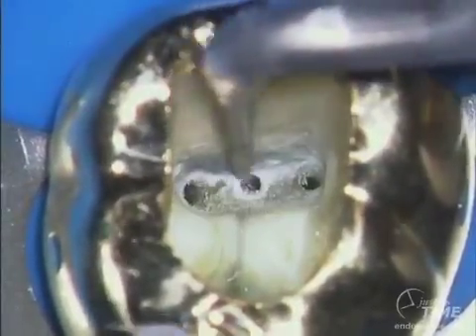Ultrasound can smooth and refine and do precise amounts of detailed work. Reserve your tapered diamonds for doing larger work. There's water-port technology if you prefer to cut wet and to float and clear out some of the remnants of our work. In the post-operative film, you can observe straight-line access, and you can see the mid-mesial is in fact prepared slightly smaller than the adjacent systems along its entire length. So in this five-system molar, we have a great setup for long-term success.